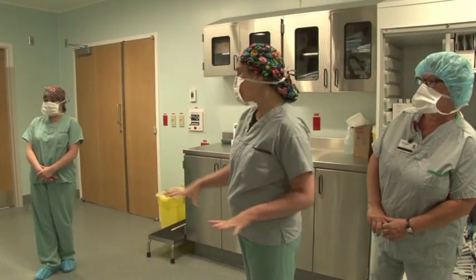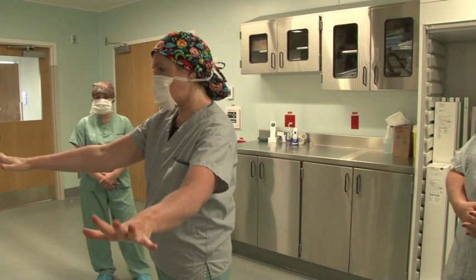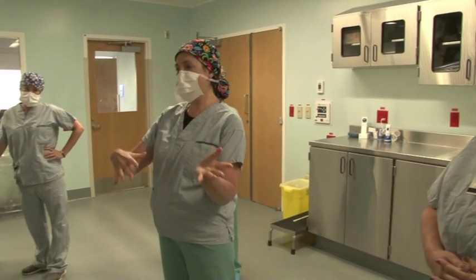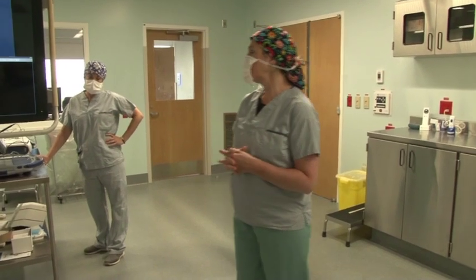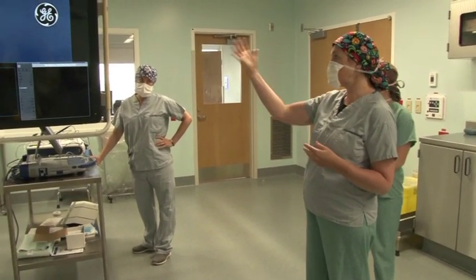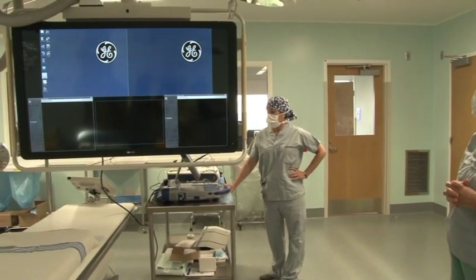We keep this area free, so when we bring the patient in on the stretcher, the patient will come over against the x-ray table, and from there we'll get them to transport from their bed or stretcher to the x-ray table. They'll be connected to our GE system. They will have monitoring on the GE system, and we also hook them up to our analyzer cables.